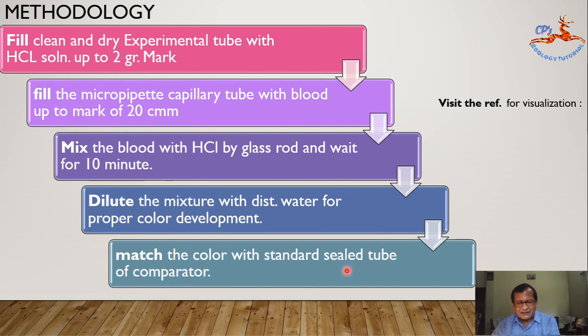The value obtained is then compared with the standard values that I have mentioned before. But remember that this method is suited only for oxyhemoglobin. In case of methemoglobin, sulfhemoglobin, or even fetal hemoglobin, the result will be different due to hemoglobin concentration.